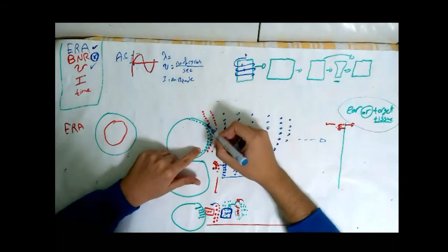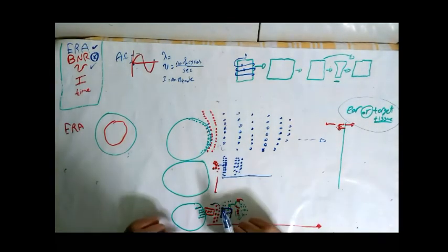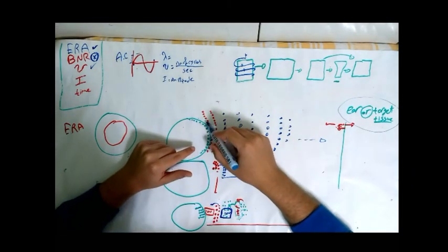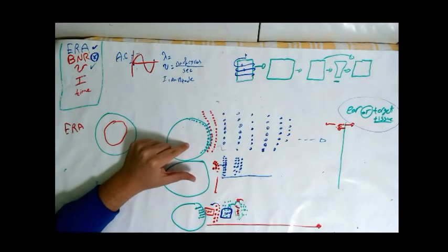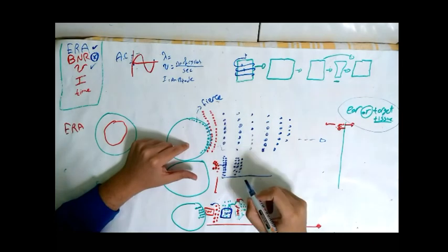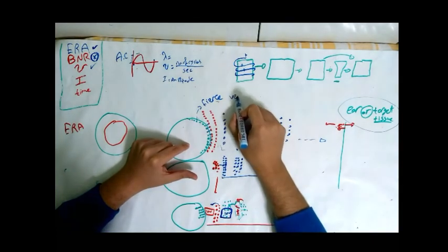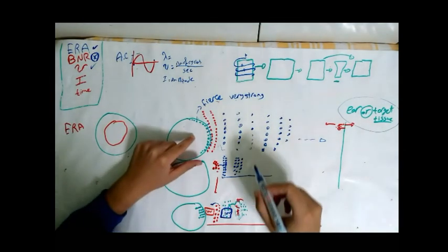So, unfortunately, the speaker or crystal is not a pure material. It has an imperfection, which means that not all atoms will push the stainless steel atoms with the same intensity or amplitude. Some atoms will be very fierce atoms, which will push very strongly.